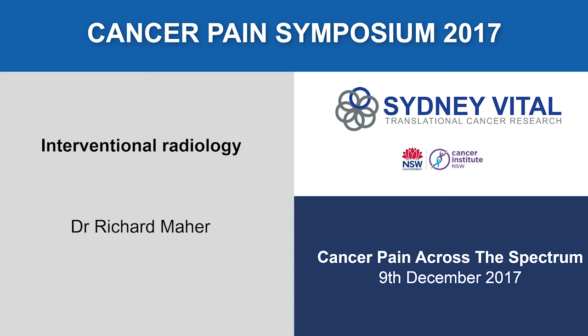There's a twofold effect on pain reduction. You get mechanical stabilisation of the fracture. It's the microfracture which causes a lot of the pain. But also if it's infiltrating, you can get an exothermic reaction apparently, from the heat of the cement, which causes some searing of adjacent nerve fibres. So in variable studies, probably at the best end of it, you can get a high rate of response.